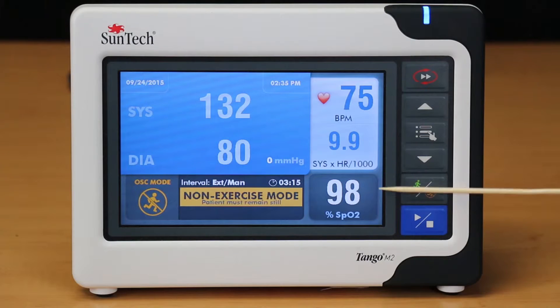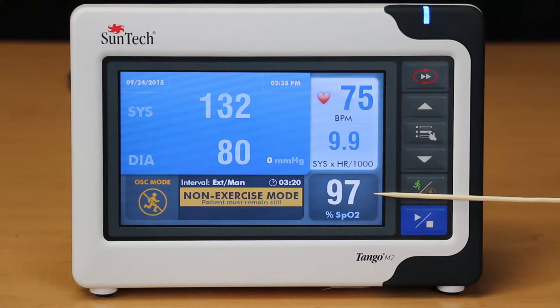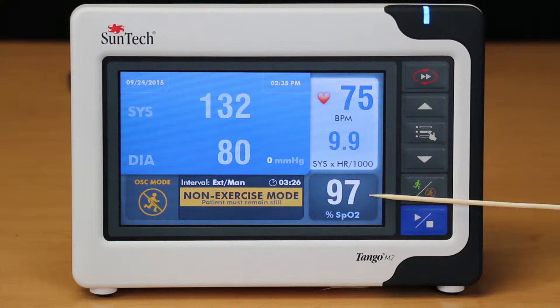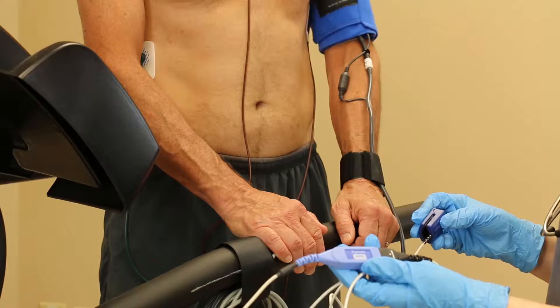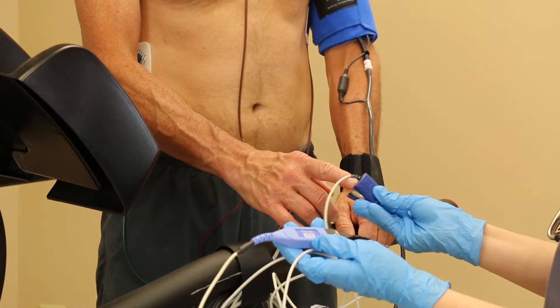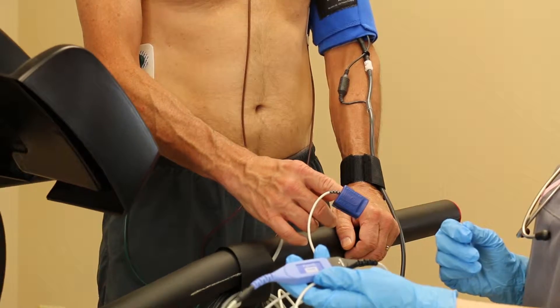Below that area is the SpO2 window. If the LPX pod system isn't connected, this area will be grayed out. When an LPX pod is connected, the SpO2 window will become active. Remember to attach the sensor to a finger on the arm opposite the arm with the BP cuff.